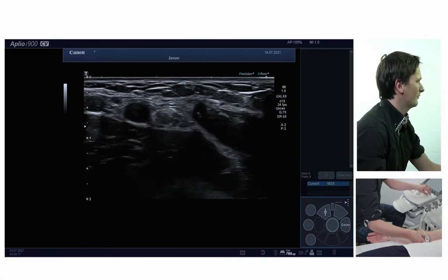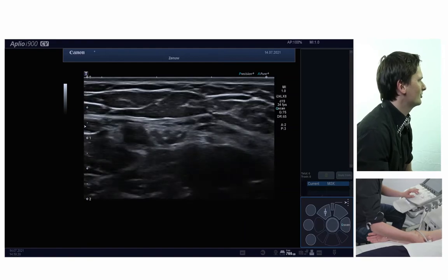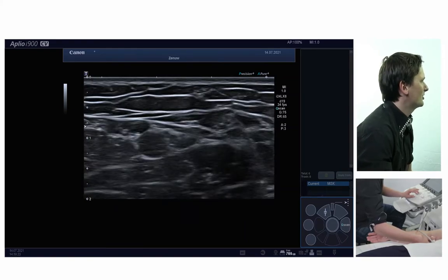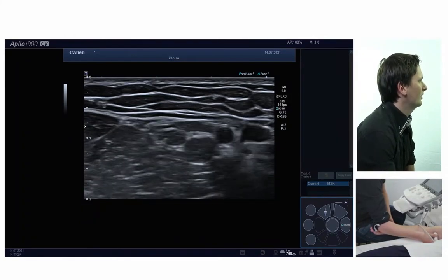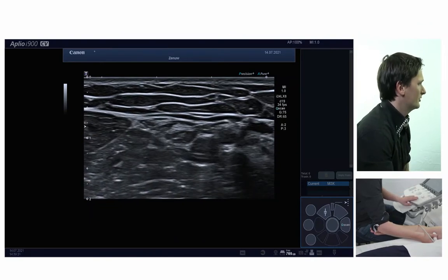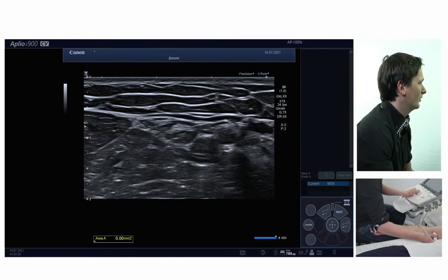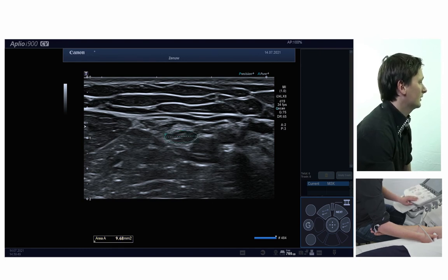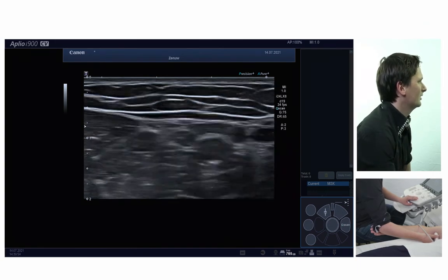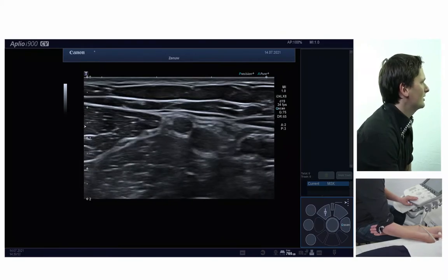I'll adjust the depth of the screen again because the nerve has a more superficial course here. The nerve is positioned right next to the brachial artery all the way along the upper arm. I can perform a measurement of cross-sectional area here as well — this is a spot where, for instance in CIDP, you can find profound nerve enlargement. But in this case that's not the case, and the normal cross-sectional area is 9.6 millimeters squared.